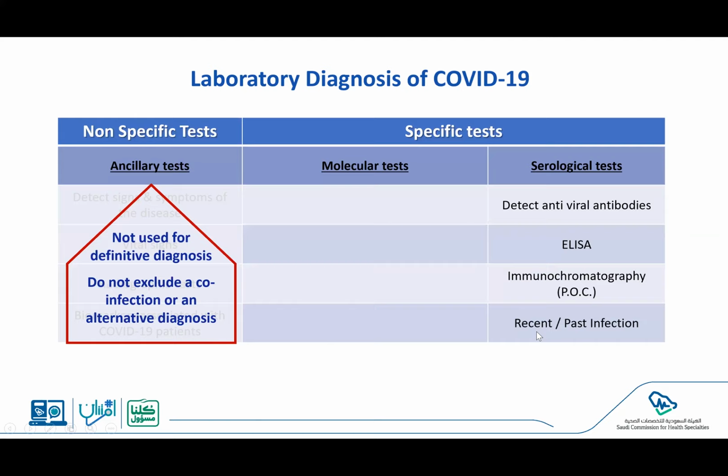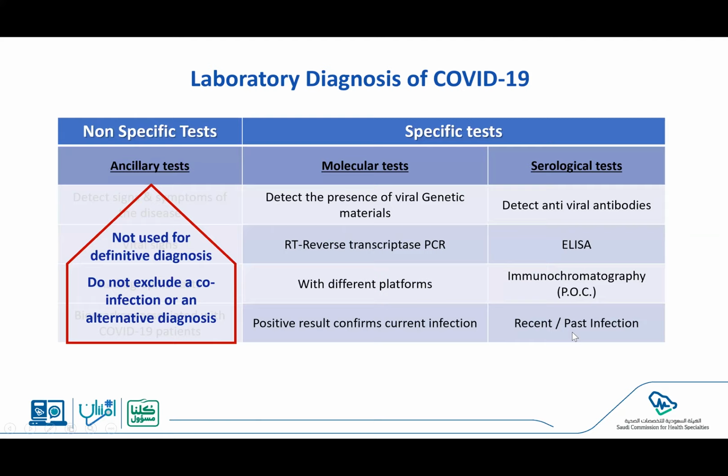The molecular tests detect the presence of viral genetic material, the nucleic acid, and they are based on reverse transcriptase PCR methodology because it's an RNA virus. Different platforms are now available, and a positive result usually confirms current infection.